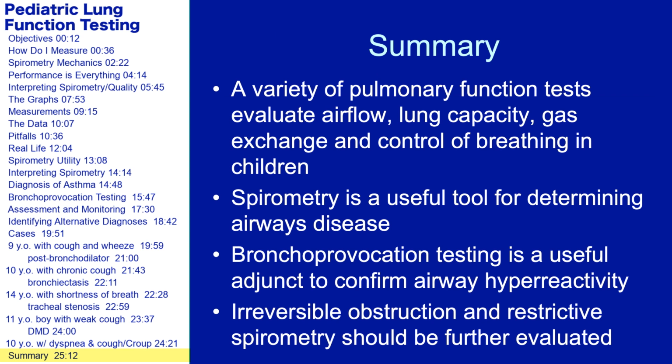So to summarize the presentation today, there's a variety of pulmonary function tests to evaluate airflow, lung capacity, gas exchange, and control of breathing in children. And identifying which of these tests will best answer your clinical question is really important. Spirometry is an extremely useful tool for determining airways disease.